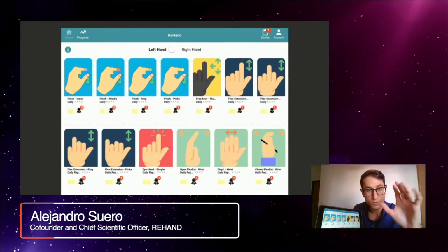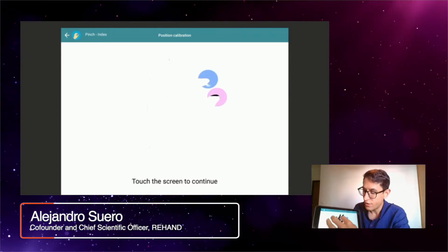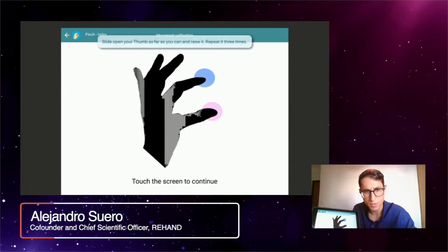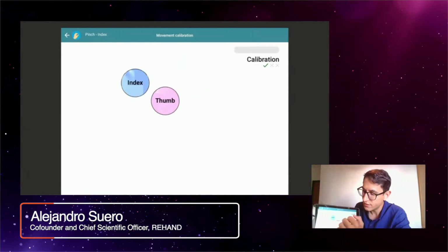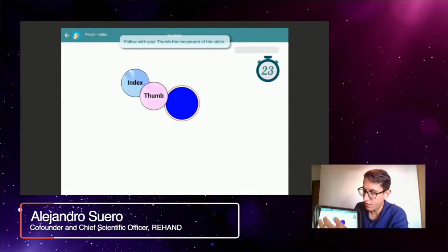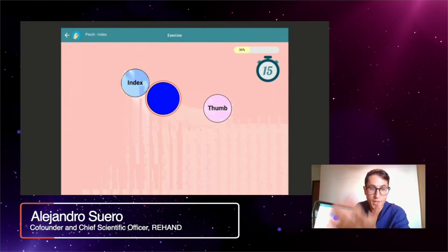So this is an example for the pinch exercise. So the first thing that the app asks you is to calibrate in order to know your status today. So here we put the initial position and the size of my hand, and then the app asks me to please tell me the range of motion without pain. So open the pinch as far as you can without pain. So with this, we take the range of motion without pain of the patient. So the app adapts to the status of the patient, and then the patient can follow the exercise. So of course, if the patient does something wrong, the screen becomes red and the app guides the patient.